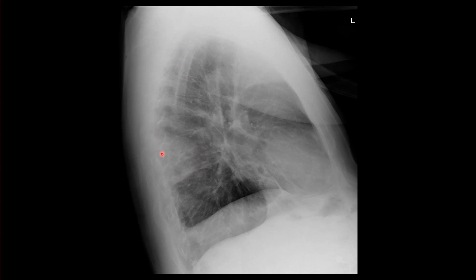Notice that it's pleural-based, extending to the periphery, and it's wedge-shaped. We also don't see any air bronchograms within it. Now, if I also tell you this patient has a history of lower extremity deep vein thrombosis, then you'd be worried about pulmonary infarction.